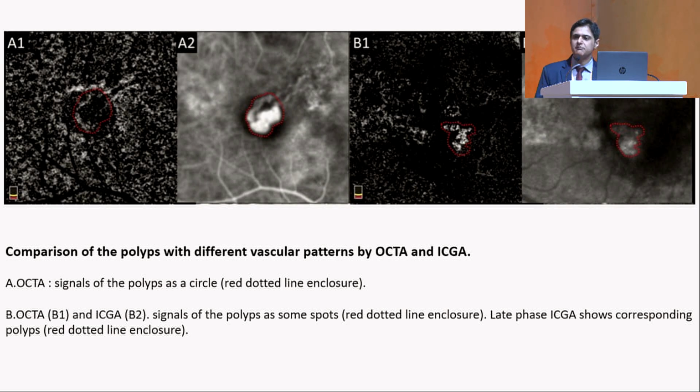Why is this? Because the blood flow is usually very slow in a polyp. However, at the edges of the polyp, the blood flow velocity is much faster, so it picks up in the form of a complete circle or a half circle. Another example is a cluster of polyps seen as hyperfluorescent on ICG. On OCTA angiography we can see white dots, which are just a cluster of polyps. If you have such a picture you can probably pick it up on an OCTA, but having such polyps is very rare.